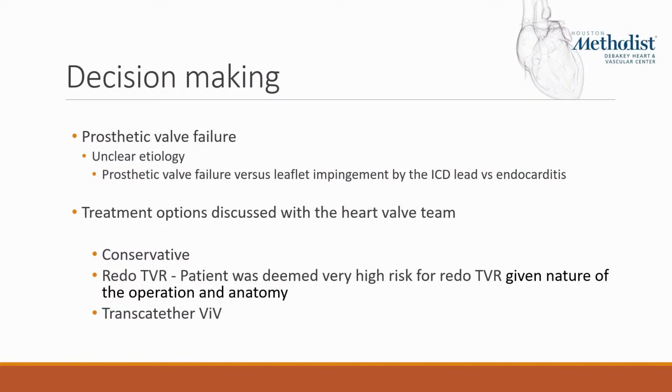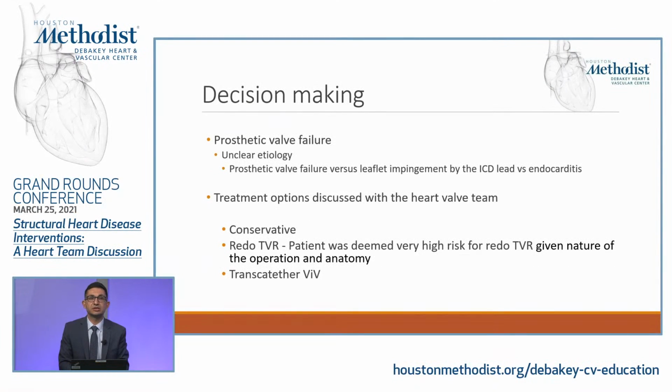Yes, so as clearly stated, this was a case of prosthetic valve failure with unclear etiology. After careful investigations and a lot of discussions, we couldn't come up with a diagnosis as to why this valve failed so quickly after the surgical implantation. The treatment options were discussed with the heart valve team. There were 3 approaches: conservative management, redo TVR, which the patient was deemed to be very high risk given her anatomy, dependence on the LAD graft, and the high risk nature of the operation. And then the last option was a transcatheter valve-in-valve option.